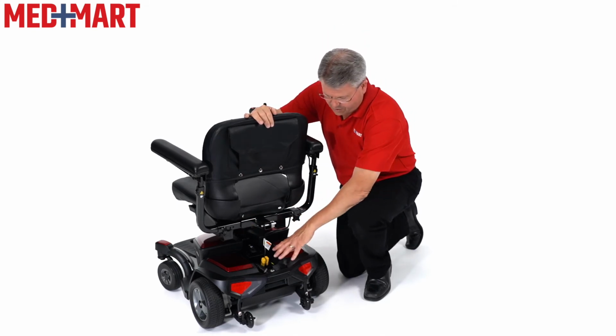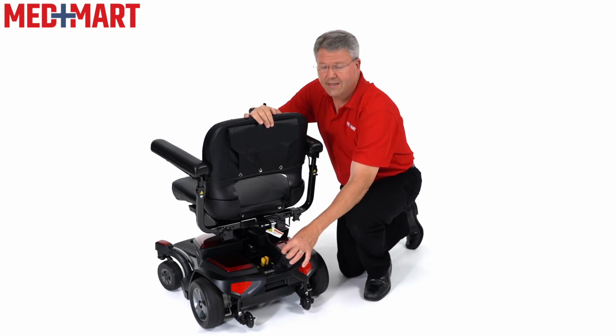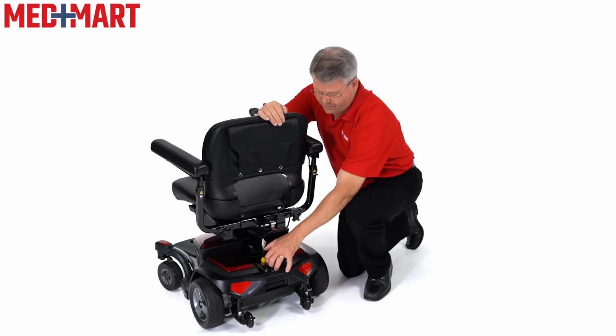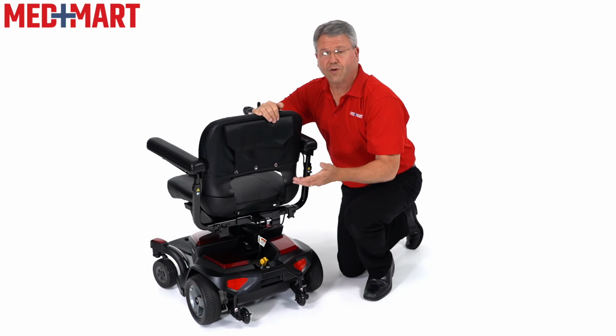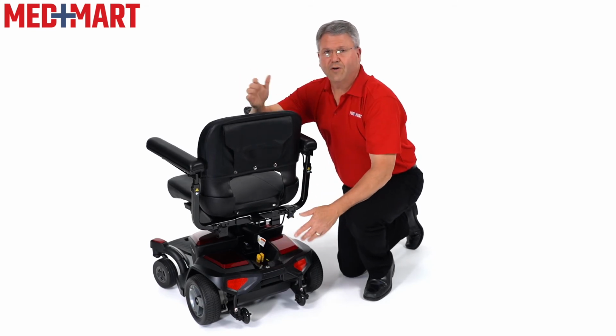So again, this is also the back of the battery. This is a point we're going to show you in a minute. When I disconnect it, I'm going to have to disconnect the seat from the lower part of the motor through this power cord here. And there's something back here called the drive and neutral switch. So if you ever happen to need to push your chair when it runs out of power, I can put it into the neutral position and allow me to push it for short distances. You always want to make sure these are up in the drive position whenever you're operating the chair.